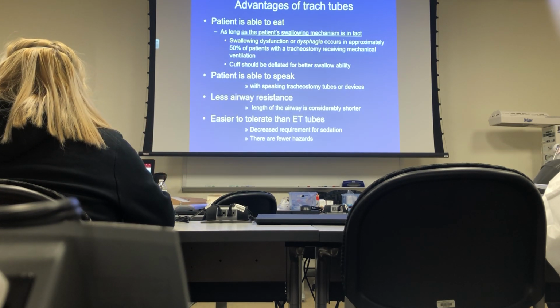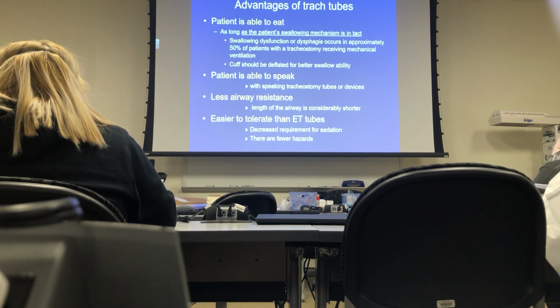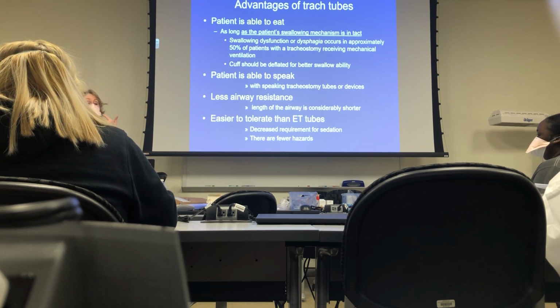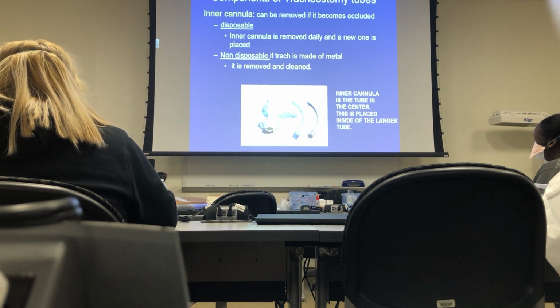All right, so what's the good thing about a trach? Well, you can talk with certain trachs. That doesn't mean all trachs, you can talk with certain trachs. If you have a good swallow and you're not on mechanical ventilation, you can eat. There's less airway resistance because the ET tube is very long. And it's easier to tolerate than an ET tube. Why? Because it's not in your mouth and it's not in your nose, okay? The obturator, we already said what it was. Inner cannula, we already talked about what that was, okay?